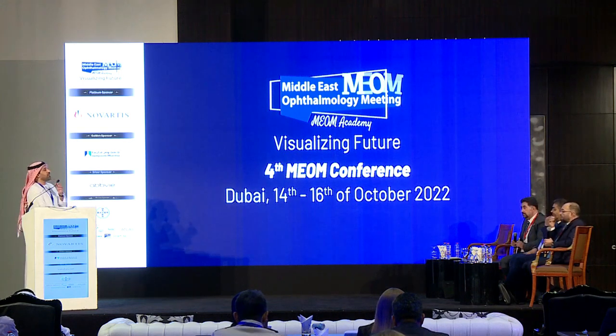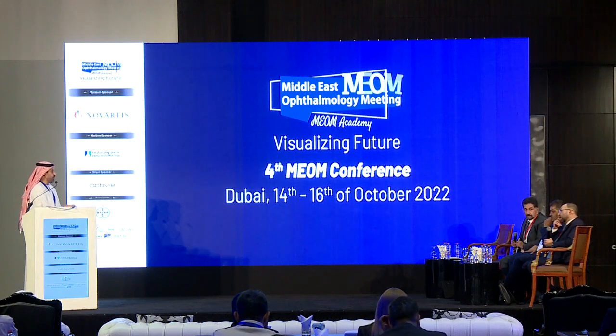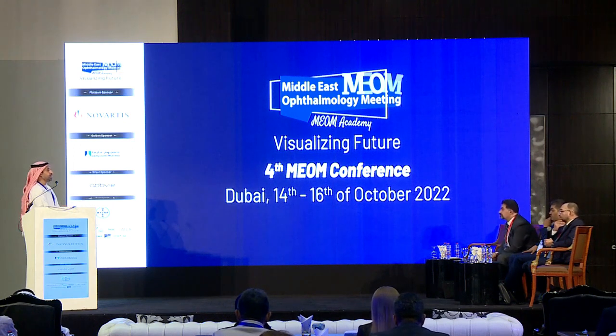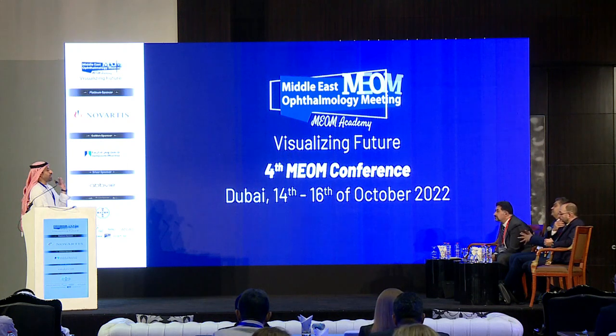But still, you have to cross-link them again, and you keep following these patients closely, especially in the first 2 years. I think I will cross-link them again. I will definitely not explant them unless it's causing high pressure, cataract, or high vault, because I'm quite confident that this patient has improved a good amount. So cross-linking again is advisable.